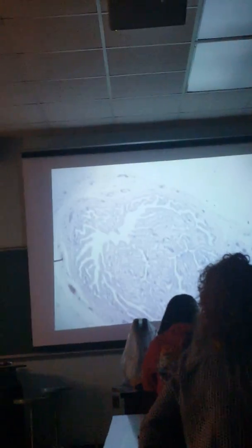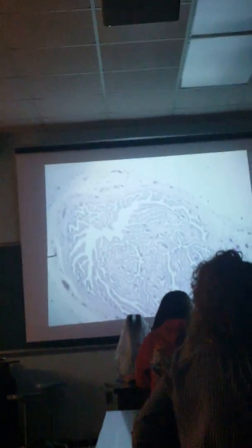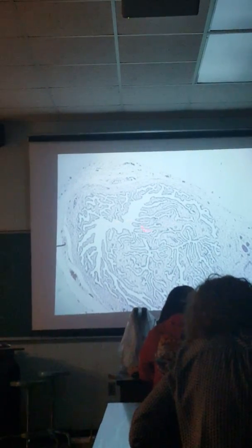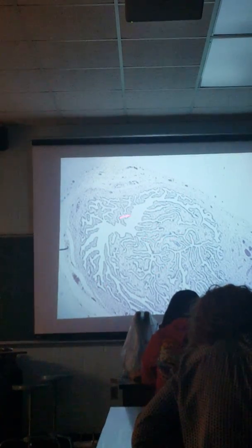And one thing that was kind of misleading on that model was it looked like an empty tube, when in fact it's not. It's quite tight and contorted. There's a lot of spaces and gaps and just nooks and crannies. That's the best way to explain it. But yeah, so this is a cross section of the fallopian tube ampulla.